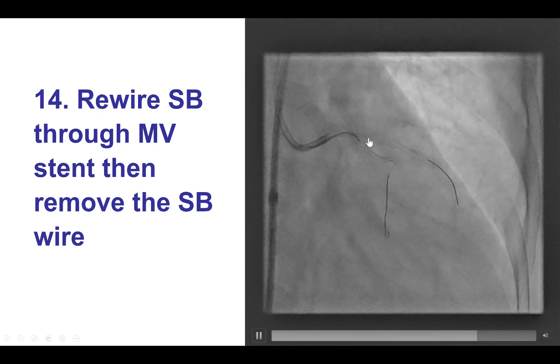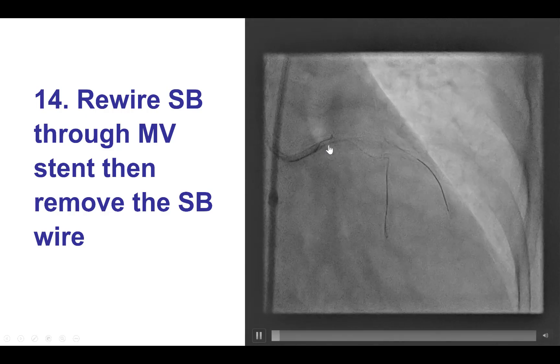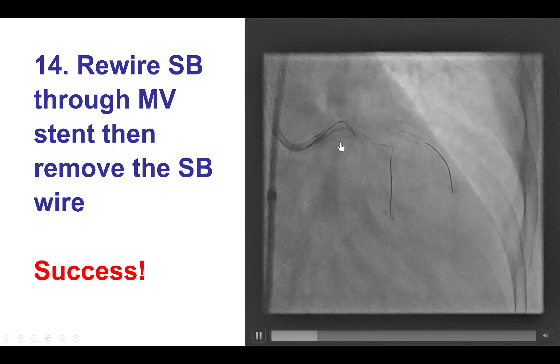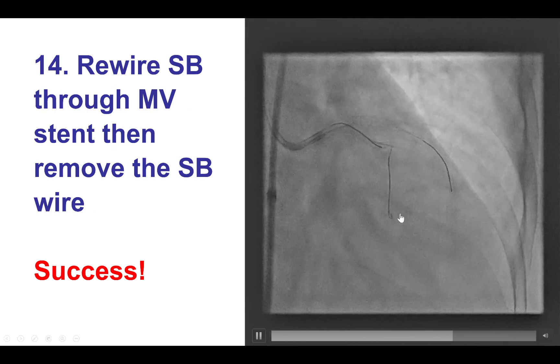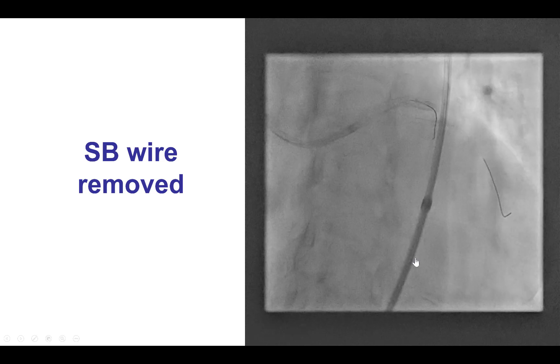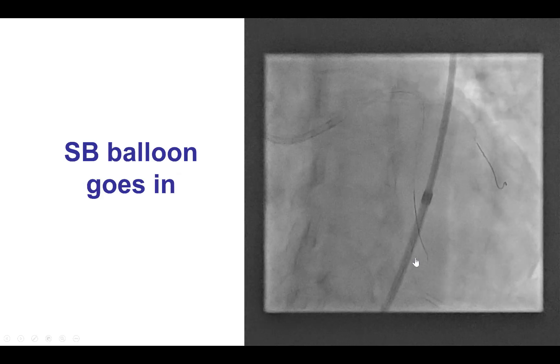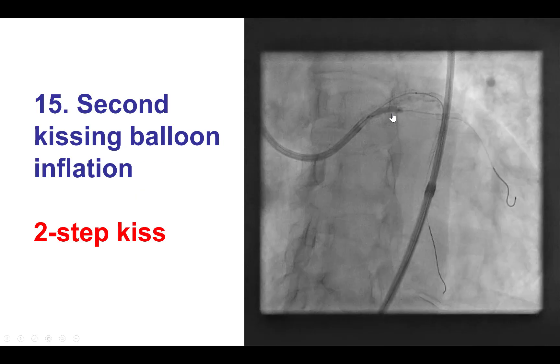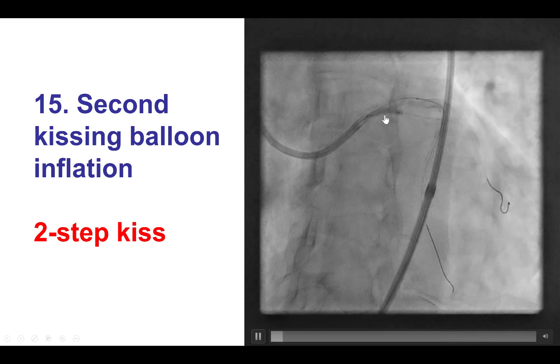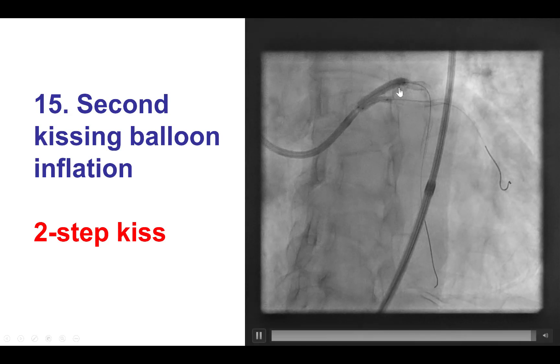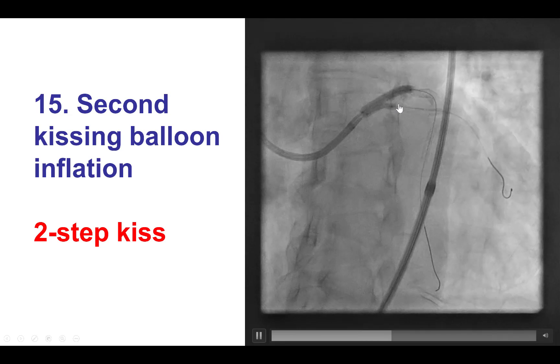Most people don't like to jail the wire, but in this case we did jail it and it helps determine which direction to go. After manipulation, we were able to advance a second wire that tracked along the first guide wire, and then we removed the jailed wire. It was then time to perform the second kissing balloon inflation. The balloon went in very easily. We performed the two-step kiss, which involves first a high-pressure inflation in the side branch to fully open the stent struts, and then a simultaneous inflation in both the main vessel and the side branch.